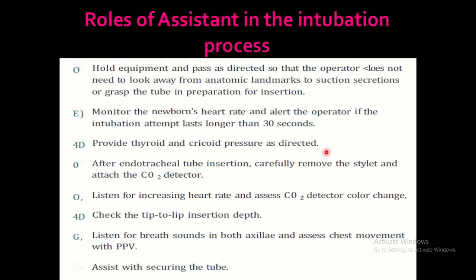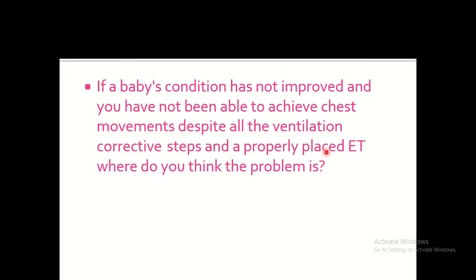pulse oximeter, and absolutely he will hold the equipment, monitor the heart rate, provide thyroid and cricoid pressure, and make sure that it is inserted at the same depth and the breath sounds are equal.